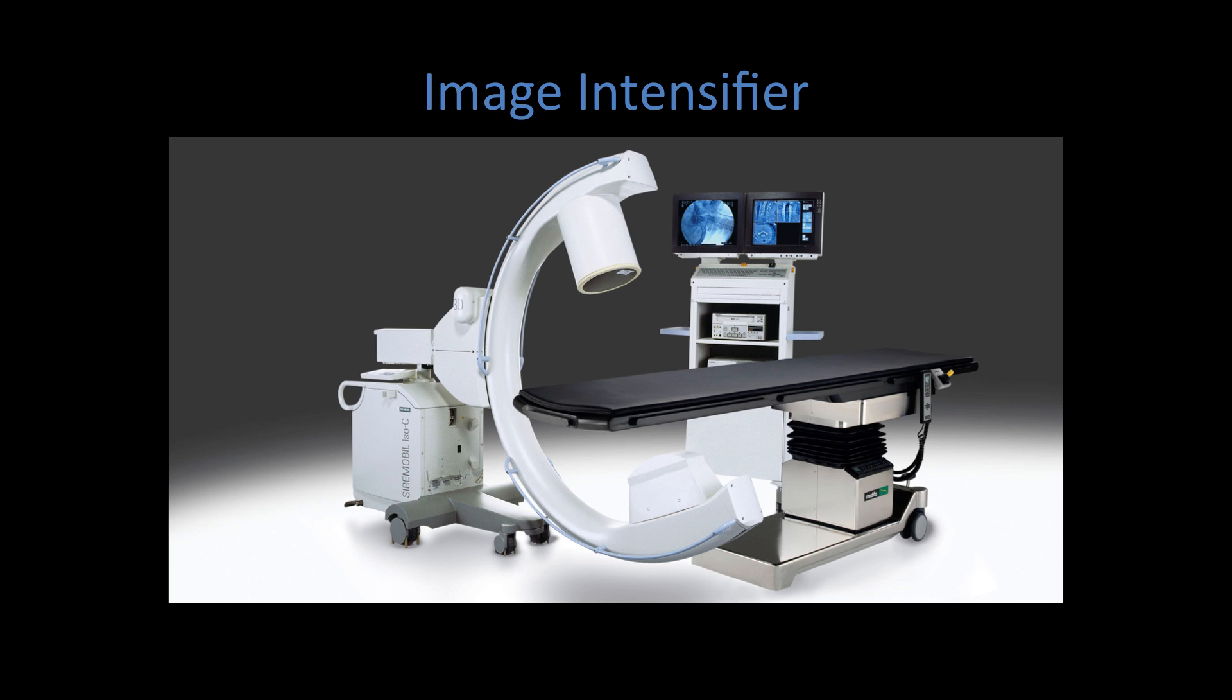Hey guys, this is a short video explaining the image intensifying system which is composed of the image intensifier tube, but you also have the x-ray generator and the TV system which is the rate limiting step in your resolution.